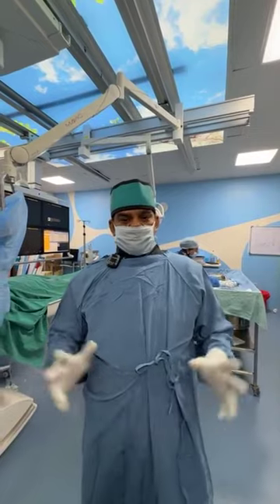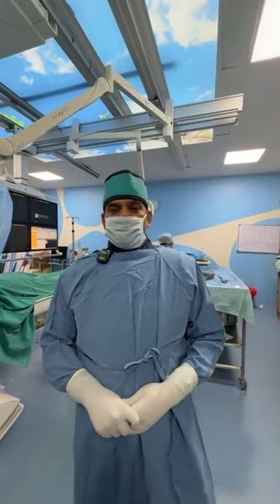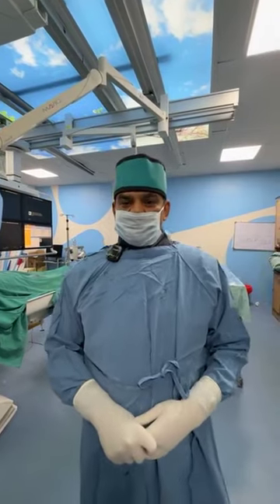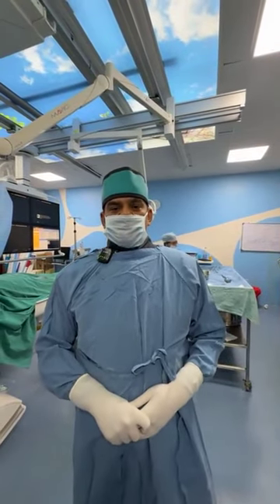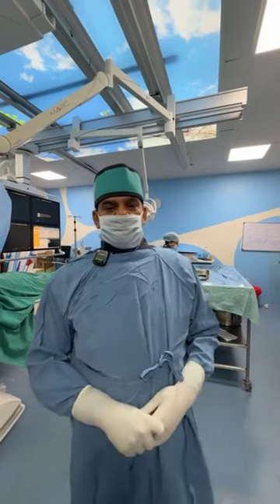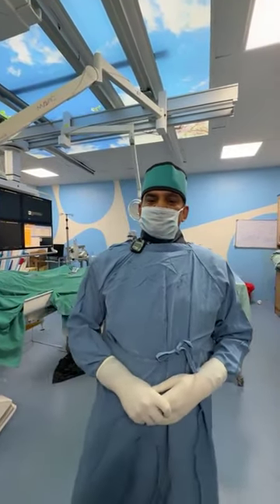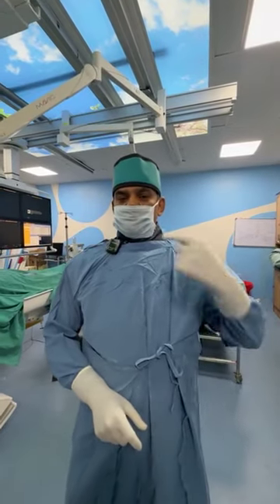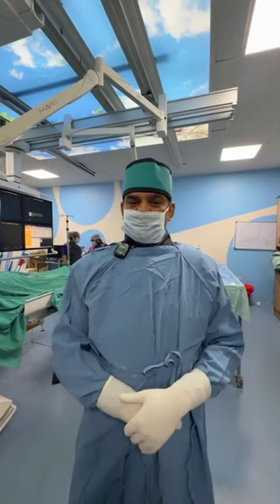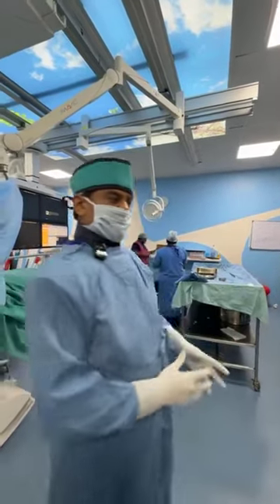So we have an interesting case today. He is a 51-year-old man, a known hypertensive and newly found diabetic, presenting to us with a complex type B aortic dissection. So we have planned for a hybrid procedure. The procedure is a surgical bypass of the left carotid to the left subclavian, followed by grafting the type B dissection. Let's look at the images.